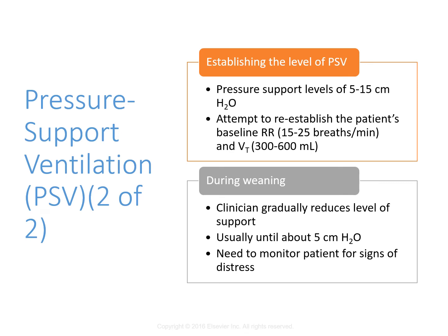The big thing there is just making sure you're taking those small steps over time to avoid the patient going into further fatigue. But usually that minimum pressure support of 5 is what's needed to overcome the work of breathing through the whole ventilator system.